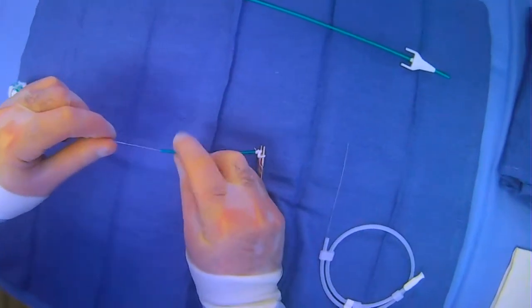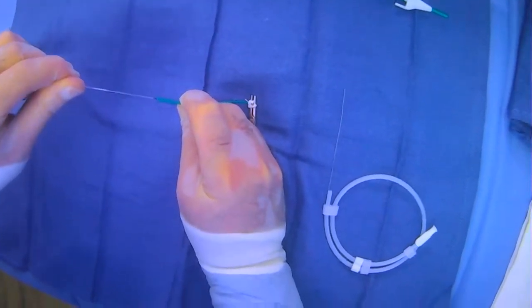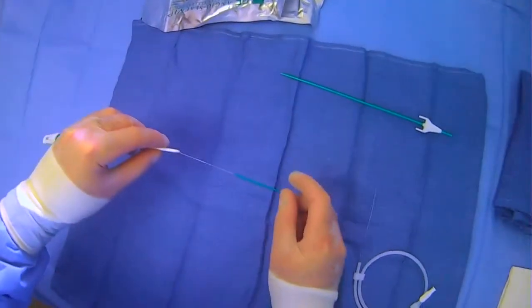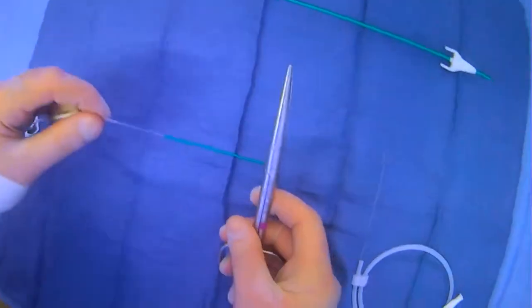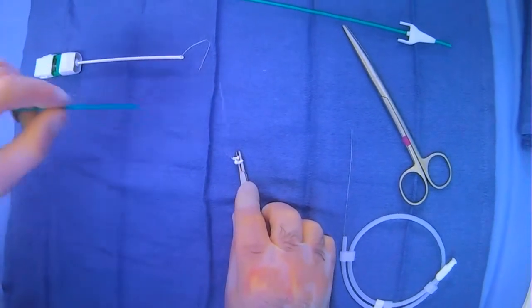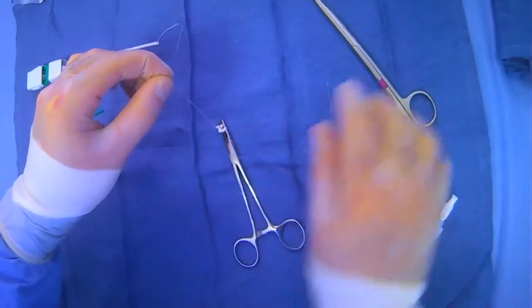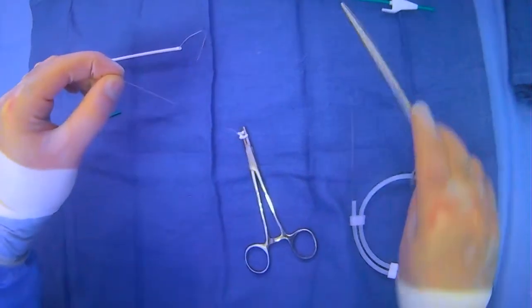You use the tamp-down device to tamp down the collagen plug that's now on the inside of the patient. You do that until you see a little black indicator, which lets you know you've sufficiently tamped things down. Then you grab some scissors and cut right above the device, and remove it.